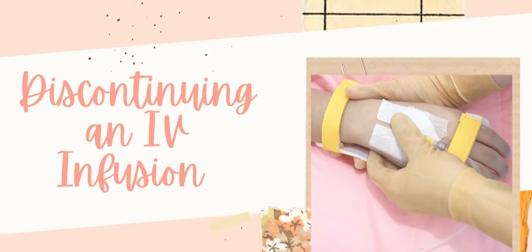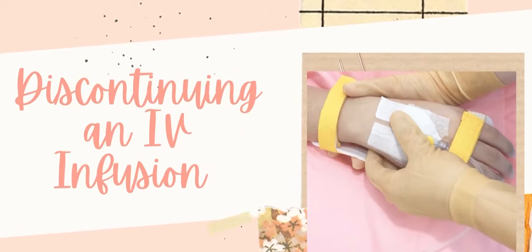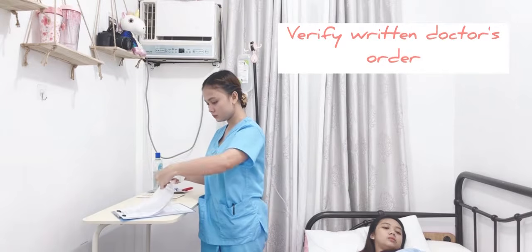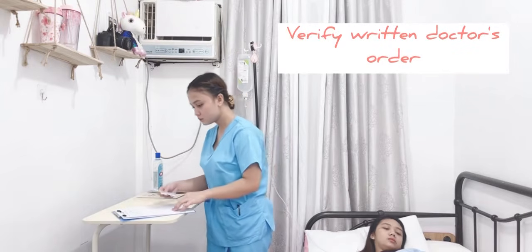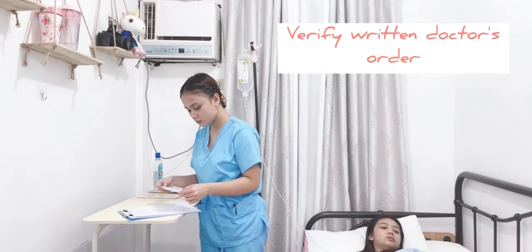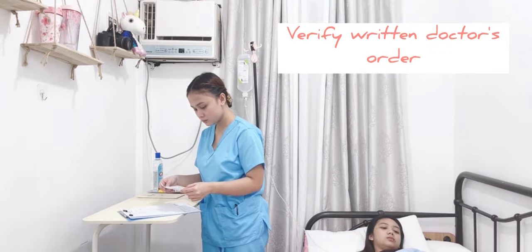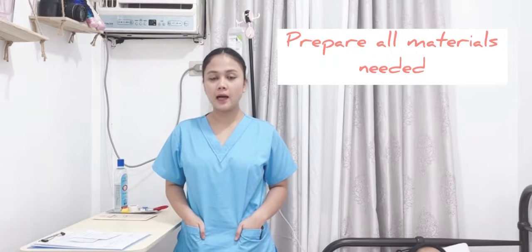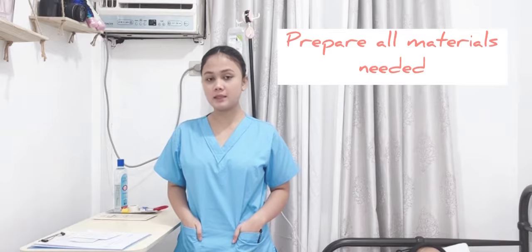Next one is discontinuing an IV infusion. First thing to do is to verify the doctor's order to discontinue IV fluid. Order is required for procedure. Before we proceed to the procedure itself, I will be preparing all the materials needed.